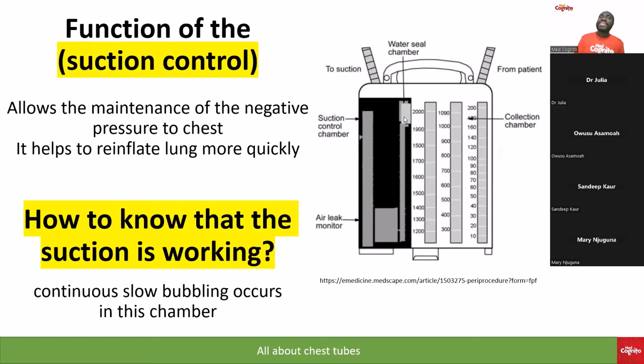And then the suction, it is sucking, right? Because we're talking about the negative pressure in the pleural space. That is why I really took time to explain why we need that negative pressure. So the suction helps to try to restore that negative pressure, which was lost because maybe pus was produced, because blood was produced, because excessive air was produced in case of a pneumothorax.